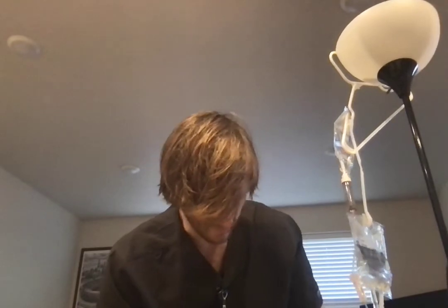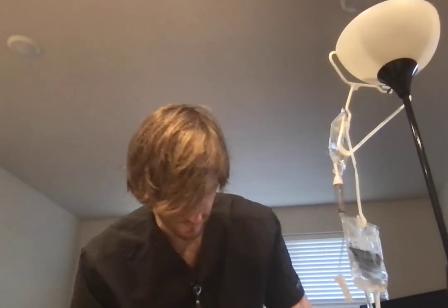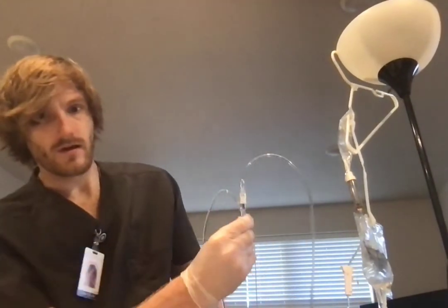And so we would take the adapter off, and then we would place that onto our Y port, looking something like that. That medication is going to be running, and we're going to make sure that our drips are happening with both of our medications still, which we see that they both are. So we're looking good. If we didn't see that they were dripping still, we would have potential cause for concern for infiltration or something like that. We would want to check their IV site and make sure that that's still looking okay.